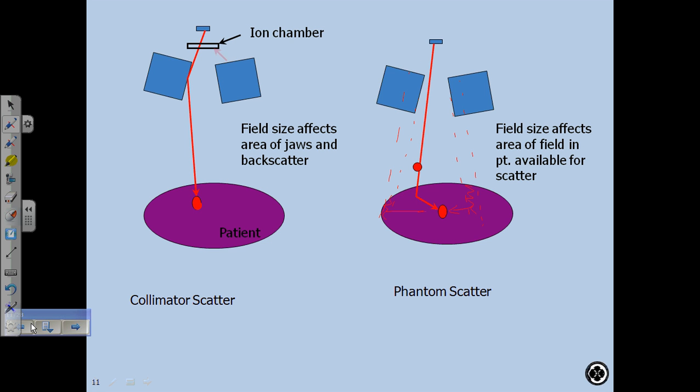To make sure that you're giving as many monitor units. Okay, and how does it work, just in general? Measures the incoming output. Measures the threshold. Okay, how does it measure? It's an ionization chamber. It measures ions, and after a certain amount of charge is collected, it shuts off the beam. Okay, and we know that there are two of them, right? There's a redundant one back there as a backup.